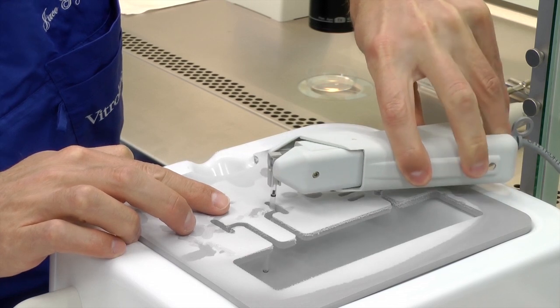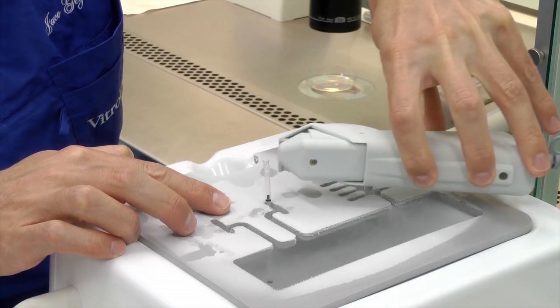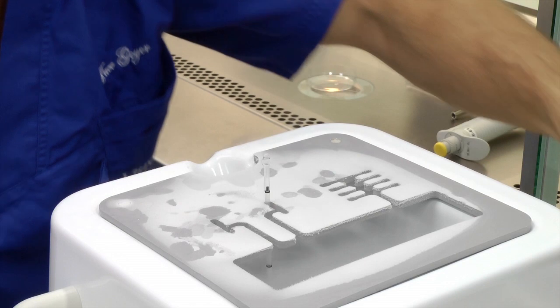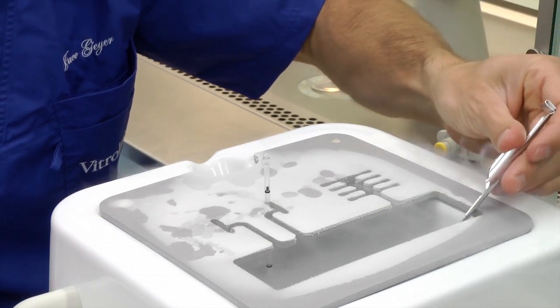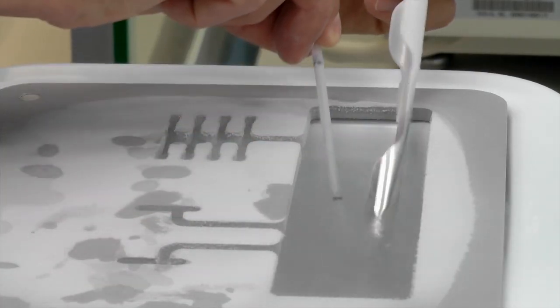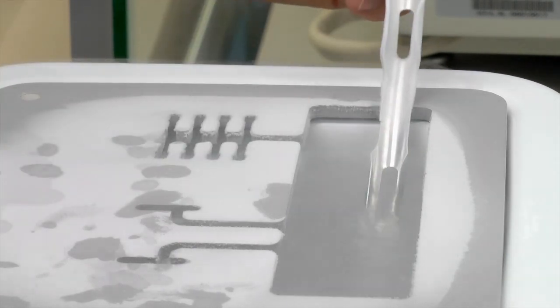Once vitrification has been done, immediately seal the straw with the ultrasonic sealer. The straw can now be moved into the cane. Make sure that you keep the oocytes under the level of the liquid nitrogen when doing this. The cane can now be moved into your storage system.